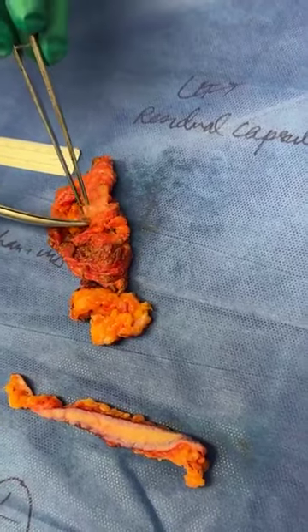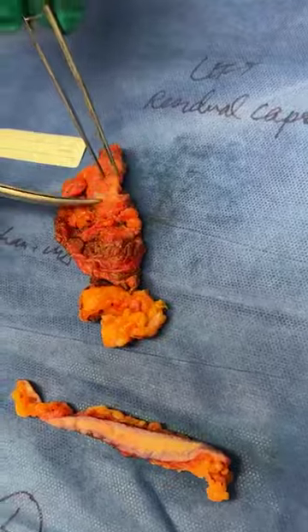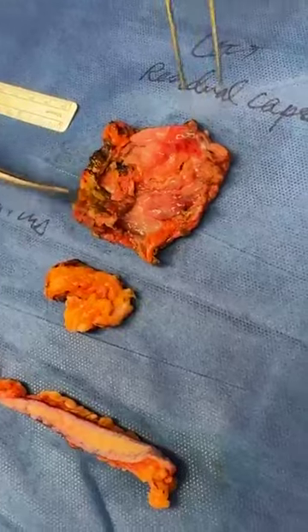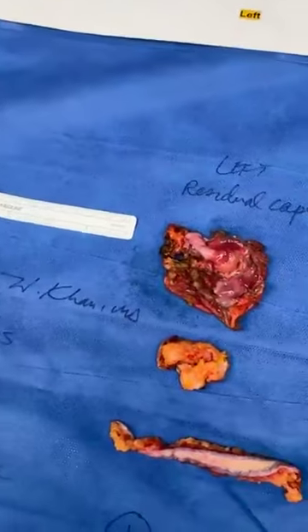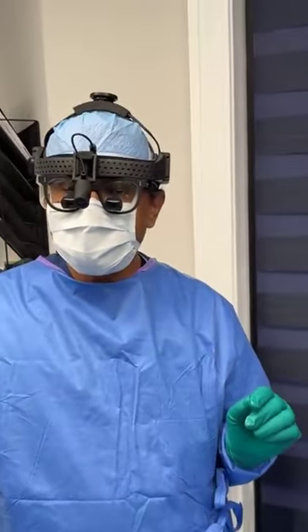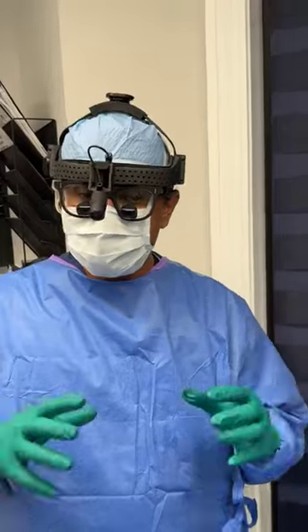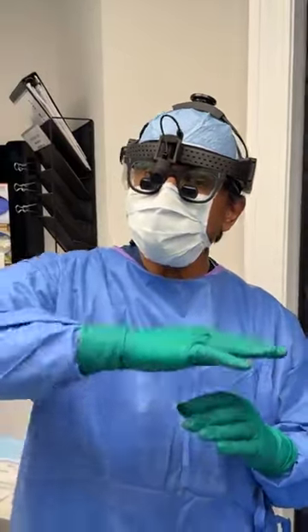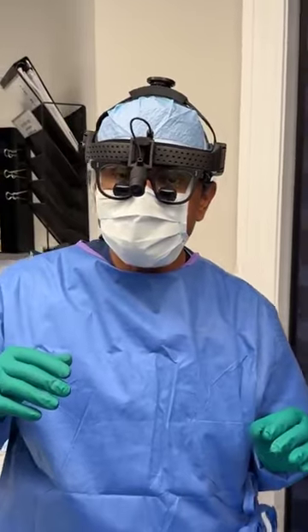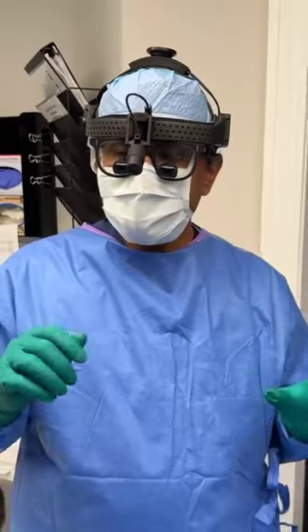You can see, look at these muscle fibers, the fascia that is on the back, all of this completely, sincerely removed such that you have only good, healthy, viable tissue. Very tedious surgery. So all the inflamed tissue, capsular tissue, and the inflamed tissue around the capsule, completely removed. The breast tissue again above the muscle, the pectoralis major, was not touched. And now I will send this out to pathology.